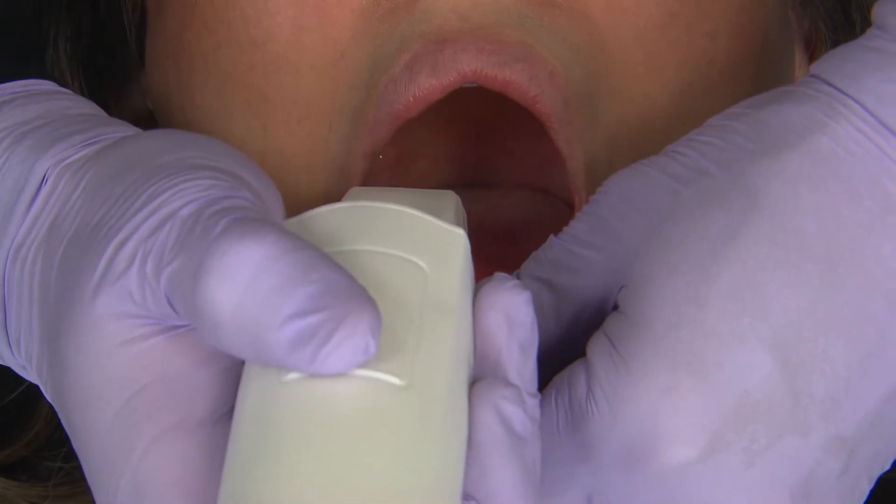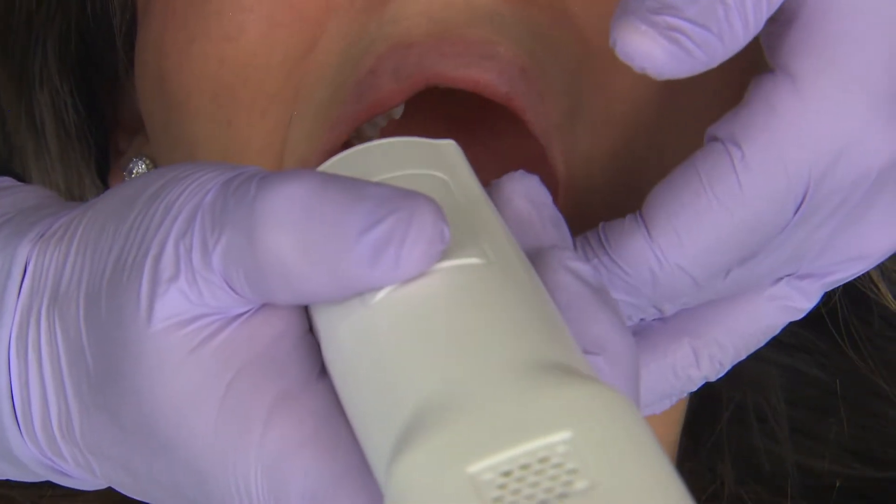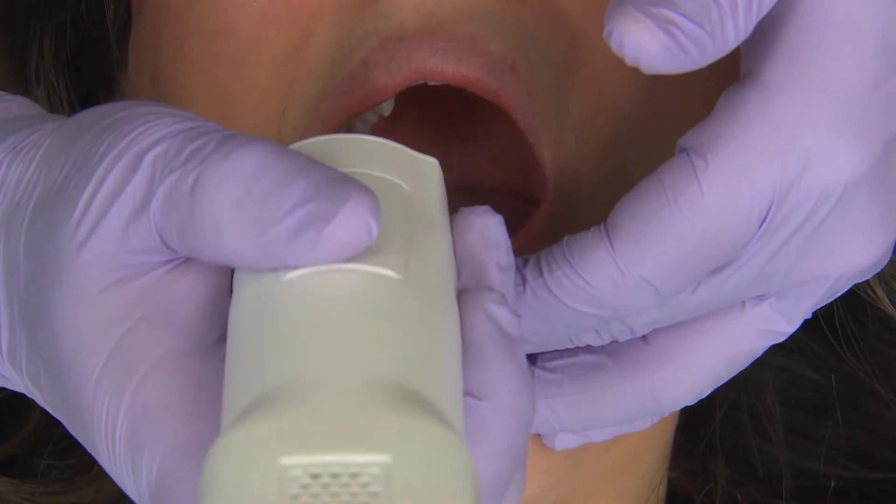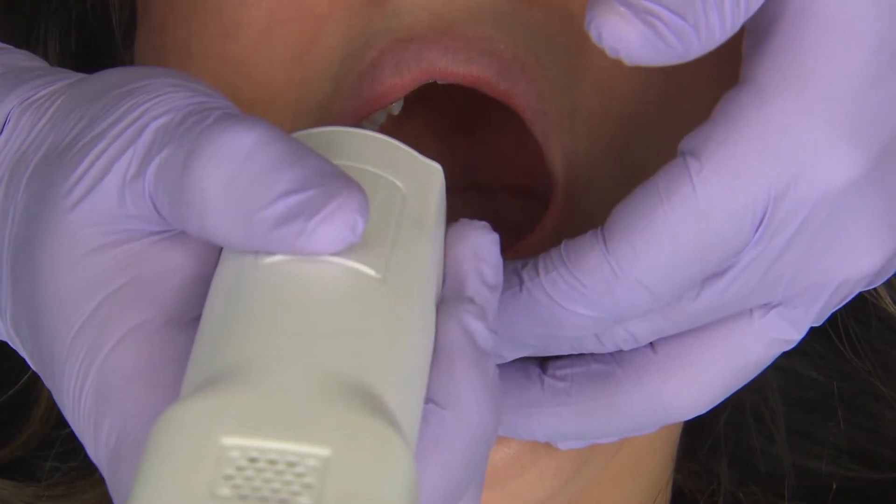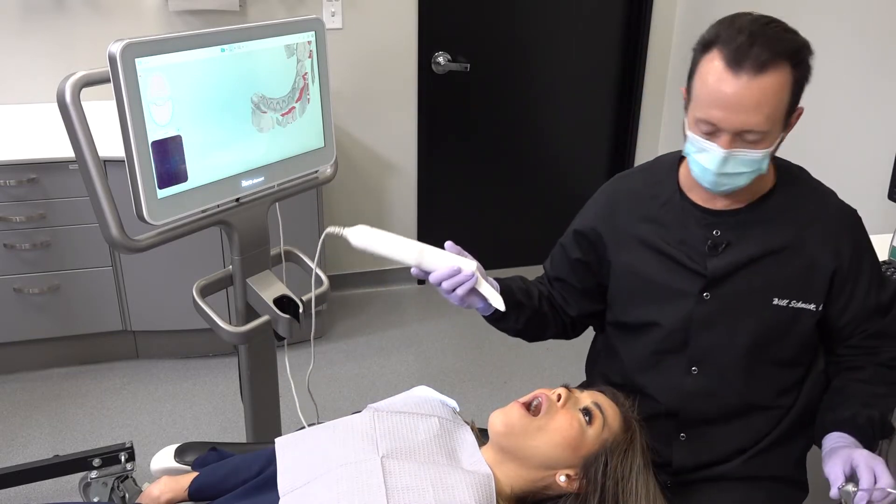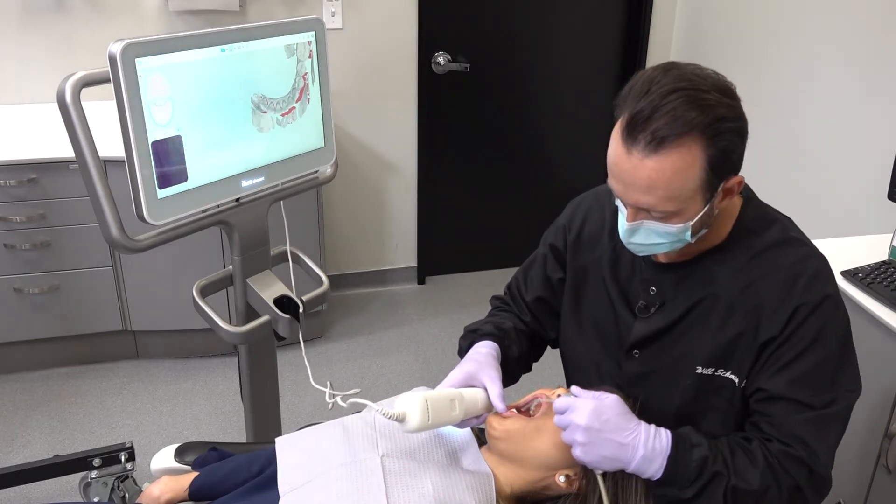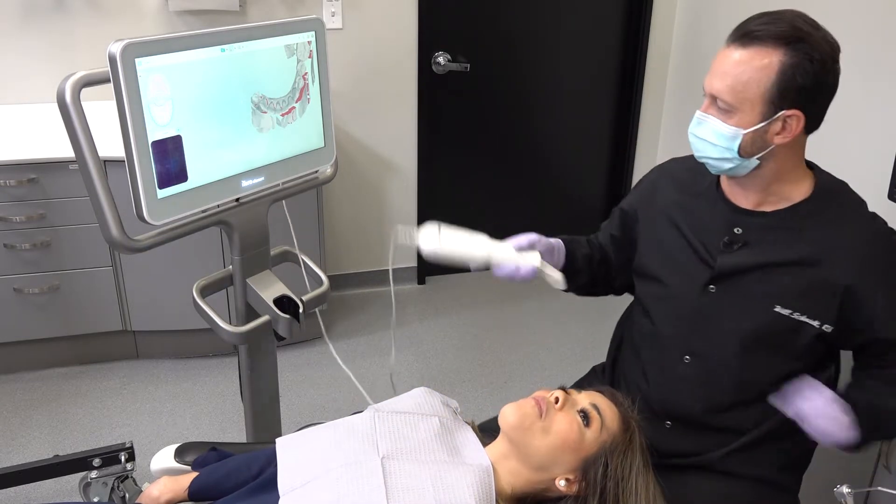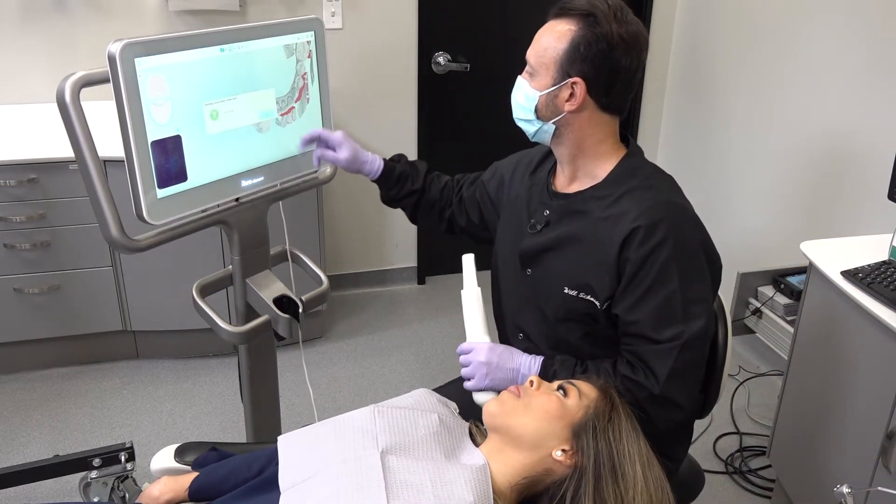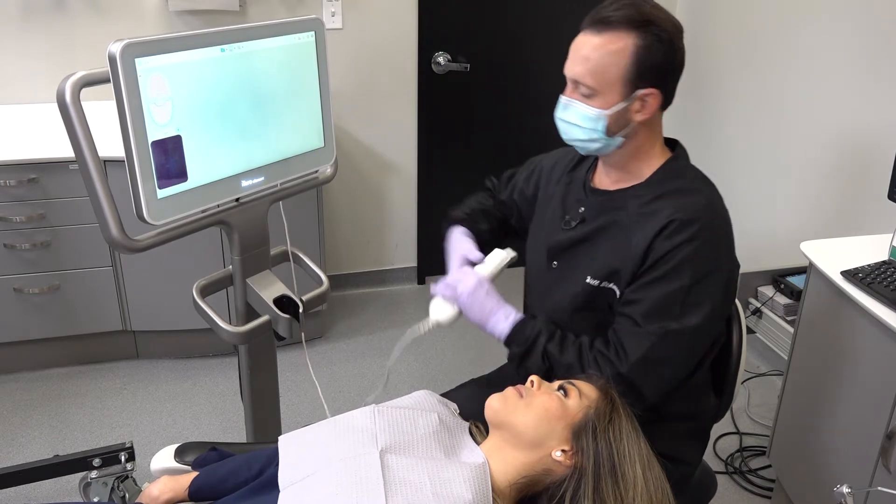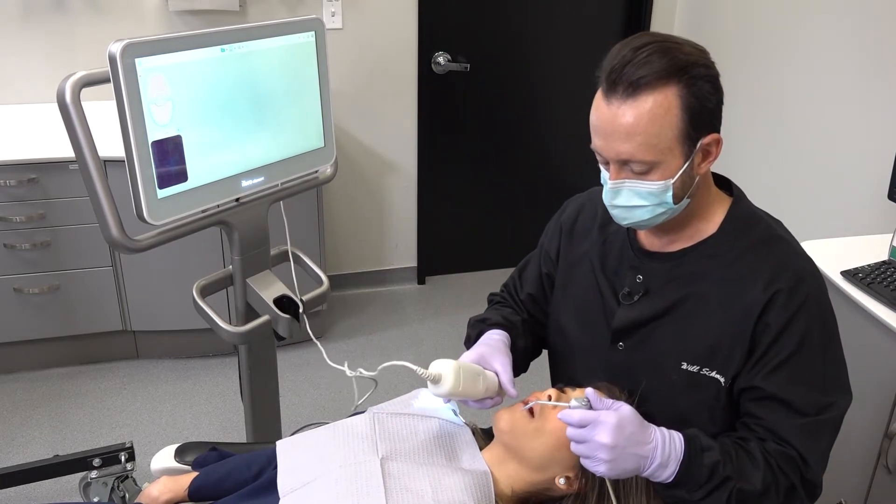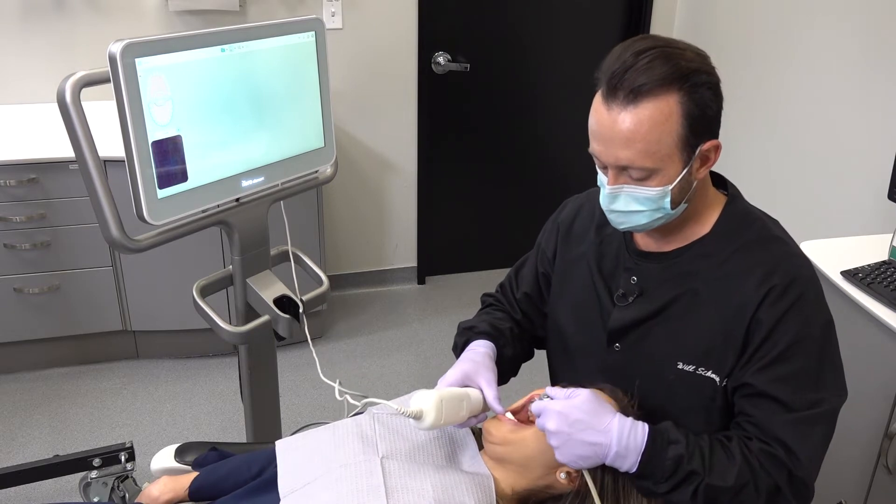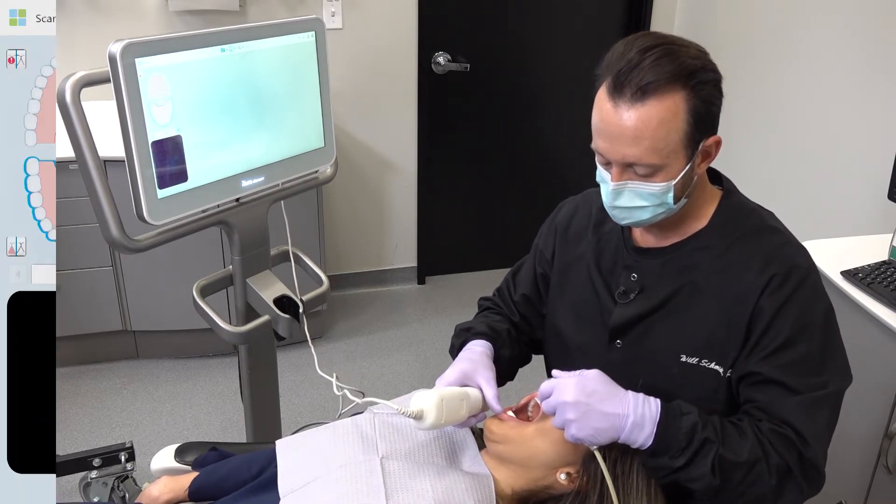I prefer to scan without the distraction of cheek retractors, mouth mirrors, props, or even suction devices that aren't meant to enter and exit the mouth pretty quickly. I almost prefer to be proficient scanning on my own. I'm sure many RDAs who will be performing scans can relate. You will most likely be operating without the assistance of another staff member. However, in extreme cases, don't hesitate to ask another assistant, a hygienist, or even your own patient to help with retraction or saliva control.